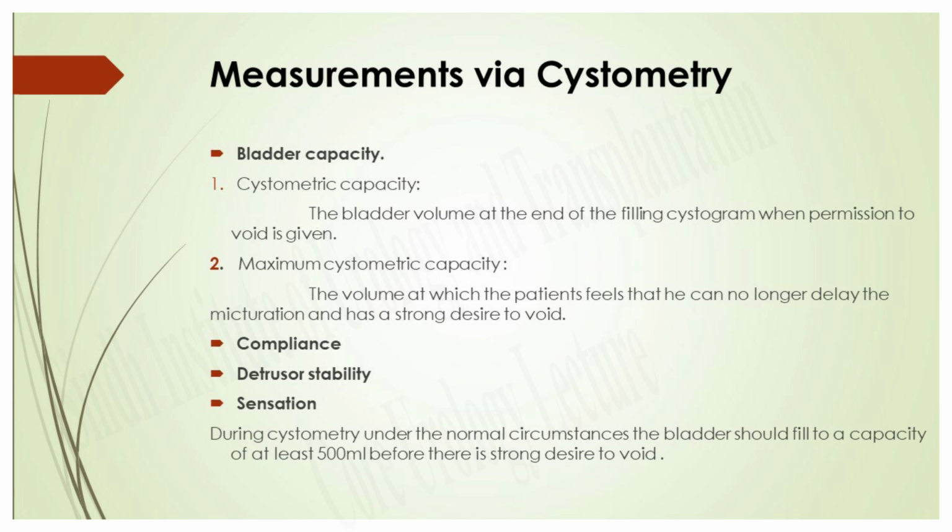Just briefly reviewing, urodynamic study is basically the dynamic study of urine storage and urine evacuation. In normal physiology, the bladder is a distensible structure. When bladder filling occurs, the bladder should distend at low pressures. When the appropriate time comes, when the patient urges to urinate, he should go to the washroom, and only then should the bladder contract and the urethral sphincter relax, with complete evacuation of the urine. The bladder should be compliant, and the urethral sphincter should be continent. This is the normal physiology.